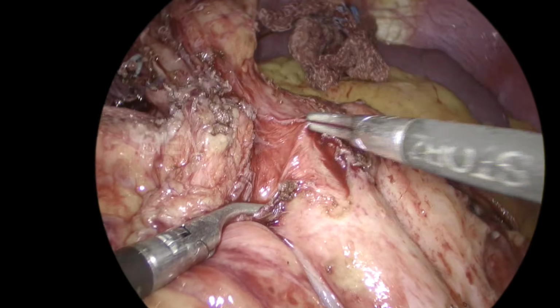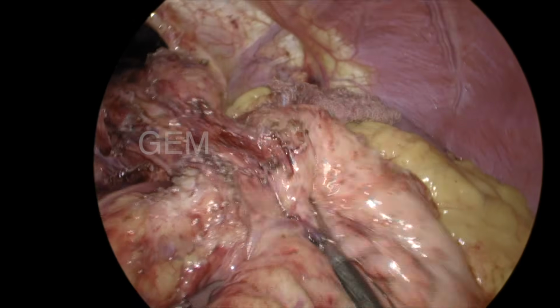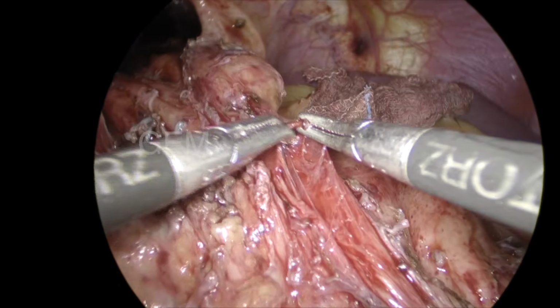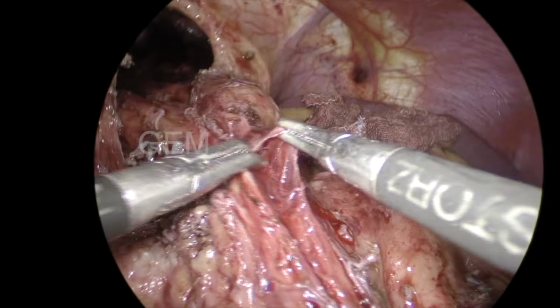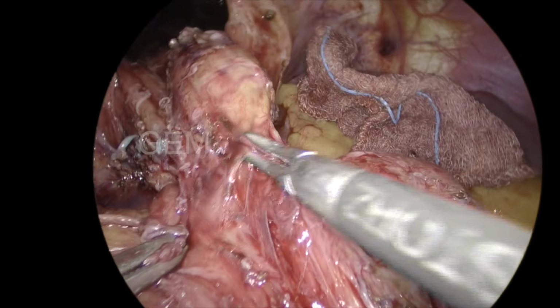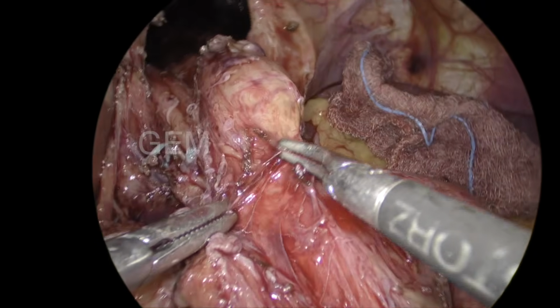I thought I have done the myotomy. I don't want to go deep because there should not be any gastric side injury. I want to confirm whether it is fully done or not. So perioperative endoscopy will give a clear idea.